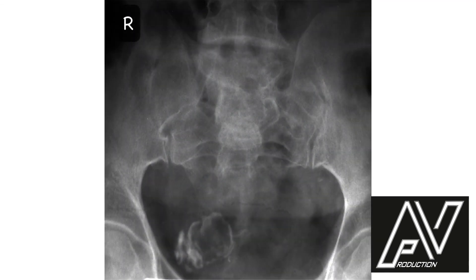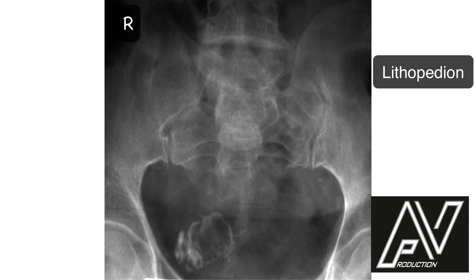This is a plain x-ray of the pelvis, AP view, showing a calcified shadow which resembles a small collapsed fetus. The crumpled skull vault bones can be seen very well. Therefore, my provisional diagnosis is a lithopedion.